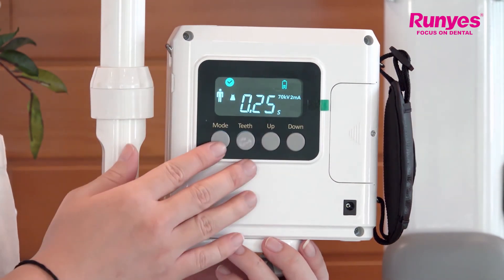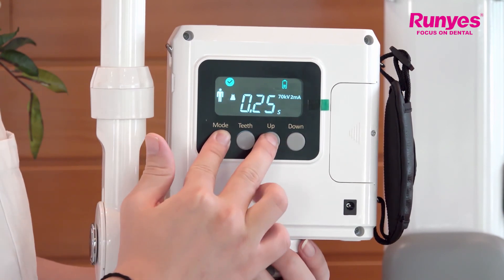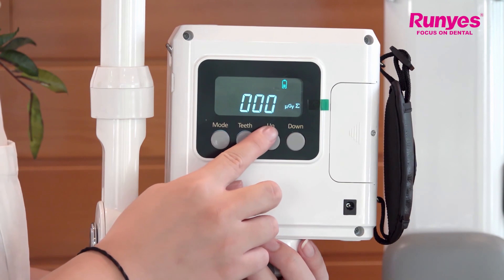We can also press and hold the mode key and the up key for five seconds. The device will clear all the cumulative dose data.